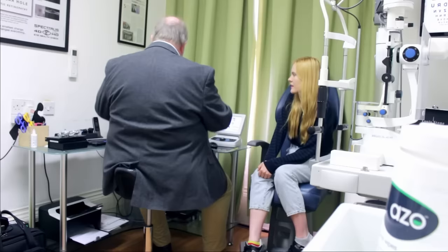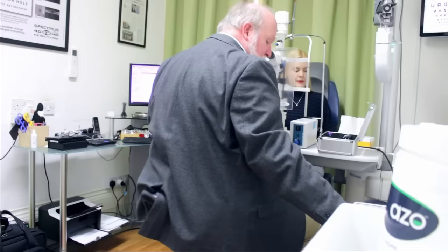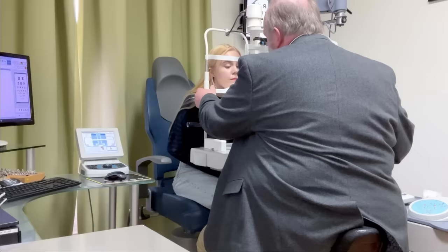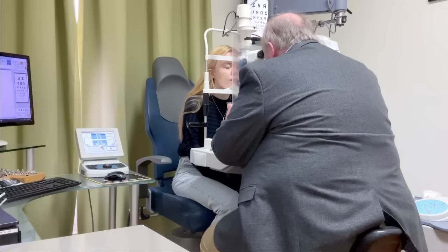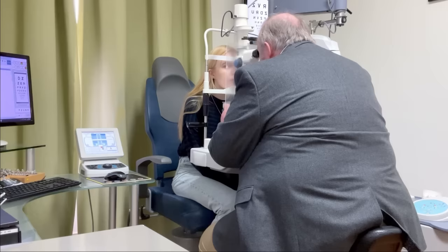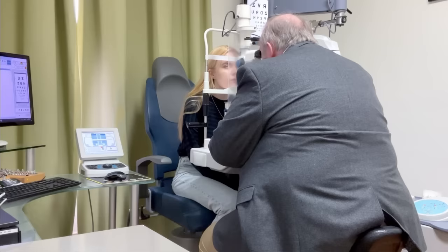So let's have a closer look at your eyes, just see what they're up to, shall we? Let's pop you onto this thing. Just a little bit. And if I can ask you just to lean forward and pop your chin on the chin rest there. Is that all right there for you? Now this is going to get nice and bright, okay? I'd like you to look at my ear this side for me. I'm just going to have a look at the outside of your eyes first. Look up for me and look down, straight ahead again.